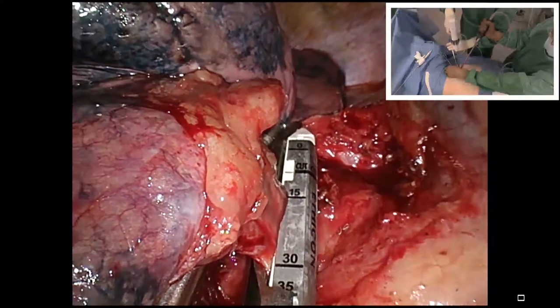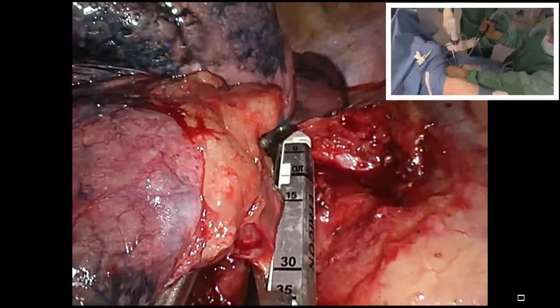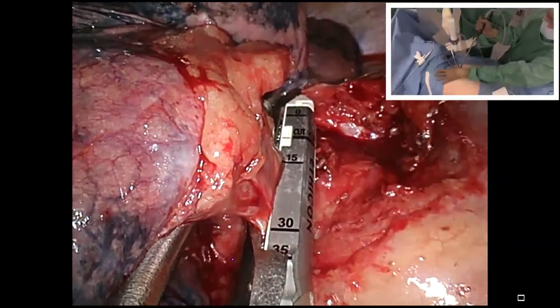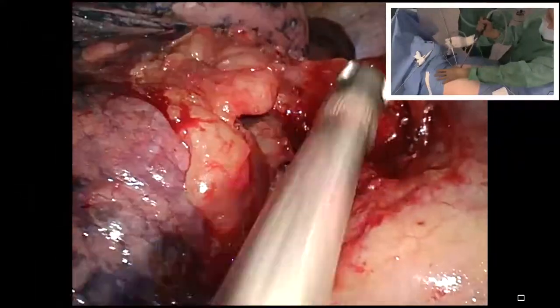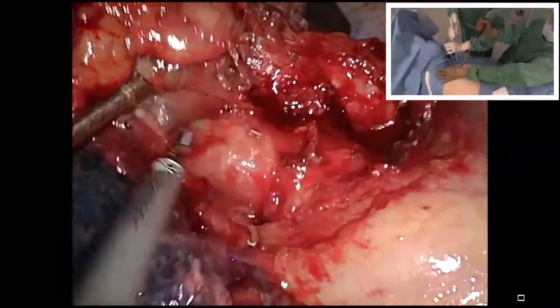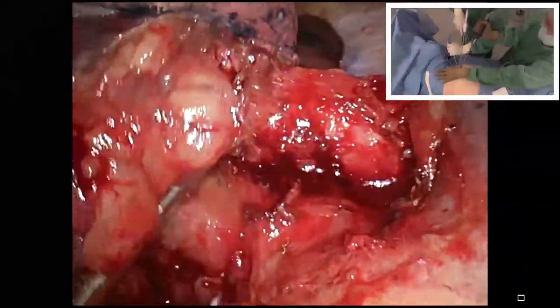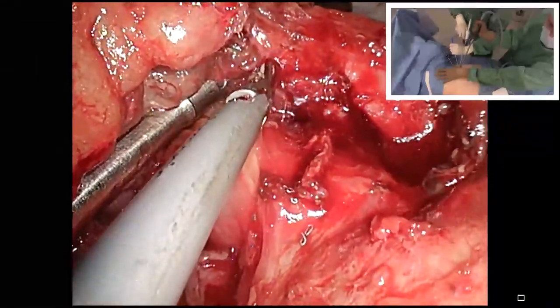Yeah, that's quite clear. And Mahmoud, did you see the instrument Diego took? Diego also prepared the place between the artery and the vein from in front. So if you make it, you are safe. He just prepared for that, so that's why he could make this step.